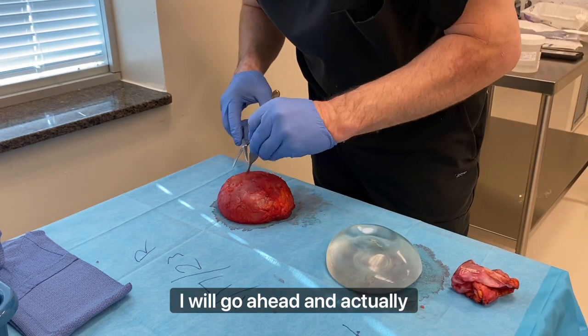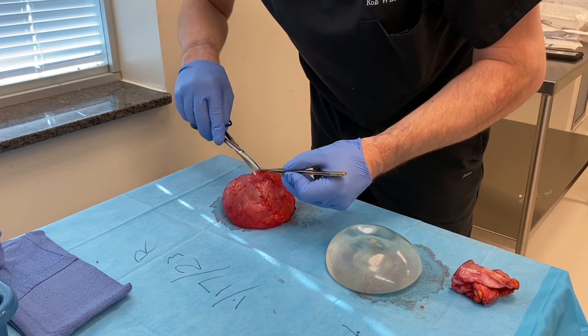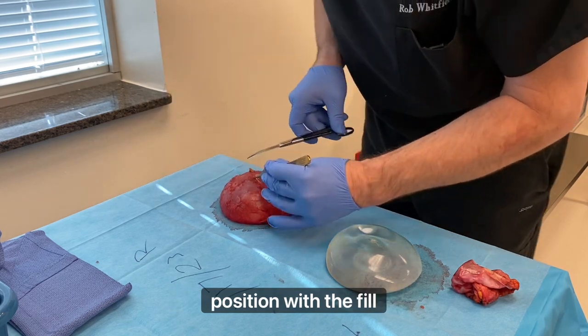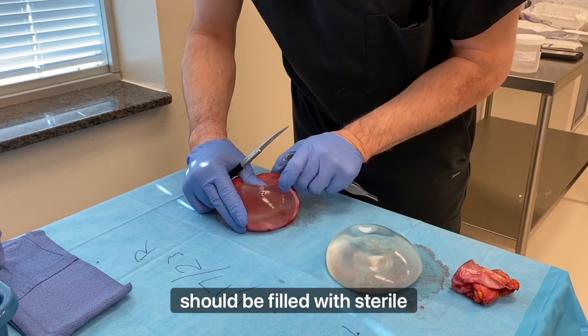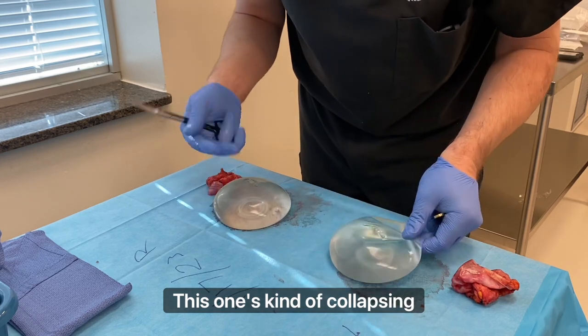Usually I will go ahead and actually injure the implant doing this because this capsule's stuck down pretty well. Here's the fill valve again. These were both in the right position. Here's the fill valve — you can see it. Everything's really clear in these; they always should be. Everything should be filled with sterile saline. This one has more fluid in it than the other one — you can see this one's kind of collapsing down.